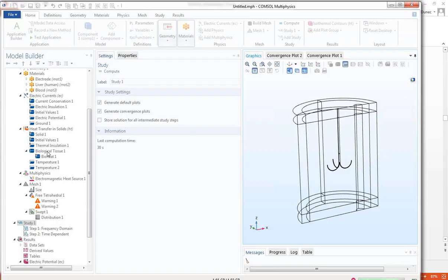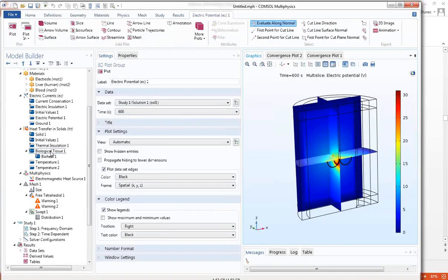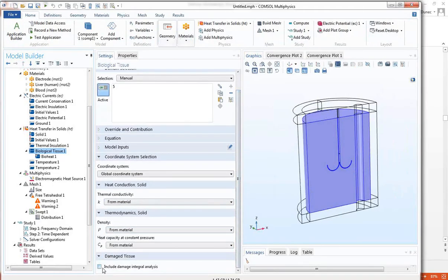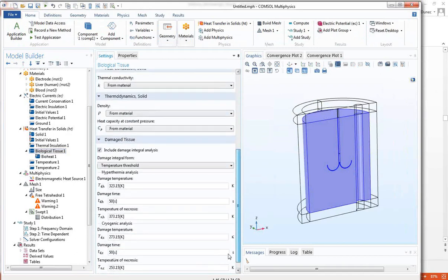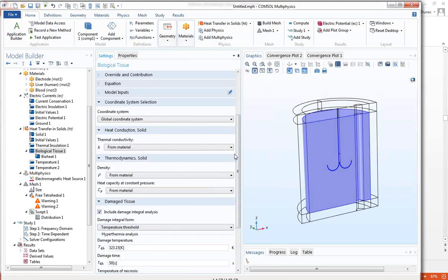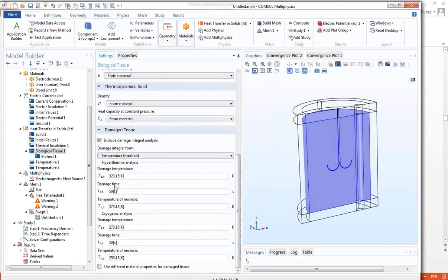There are 2 types of that. There's either a temperature threshold one or an energy absorption one. The temperature threshold says, if you're higher than a certain temperature, what's going to happen? So let's go look at that. I go down here in the biological tissue, include the damage integral, and you can choose one of energy absorption or not. Let's switch it back from energy absorption to temperature threshold. And if you notice, we have 2 thresholds here. If you go above 100 degrees centigrade, you're boiling, so obviously it's just not going to like that.